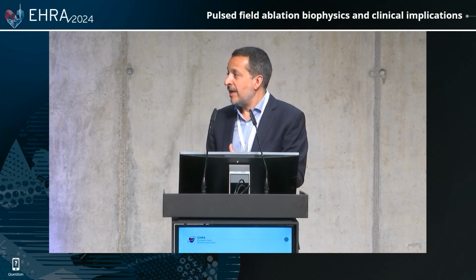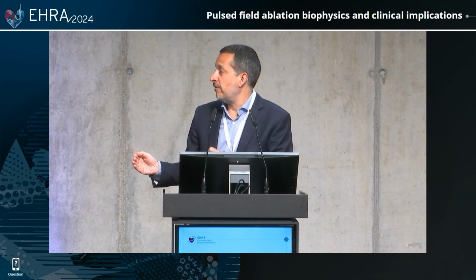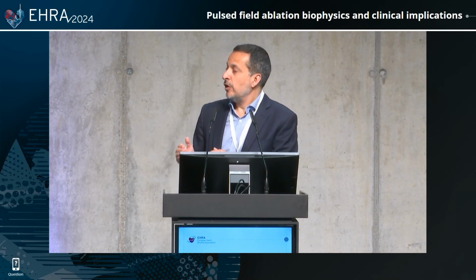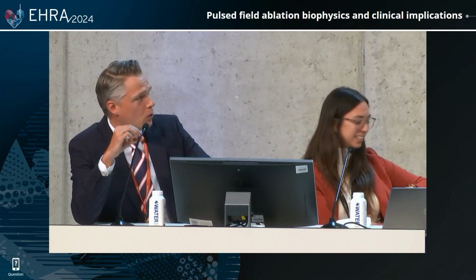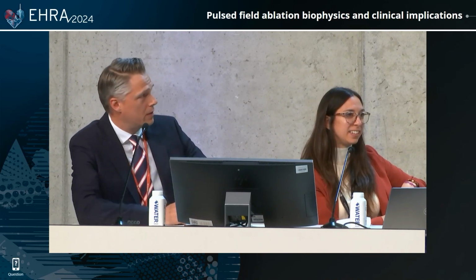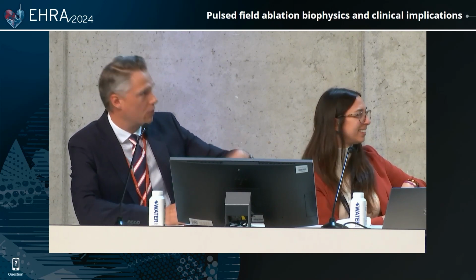The problem is that electroporation is reversible or irreversible. But right now, we don't have a clear marker to see reversibility acutely. When we look at MRI data, for example, we look at many patients with MRI, we see that when we have thermal lesions, there is a lesion after 3 months, 6 months, 12 months, whatever.